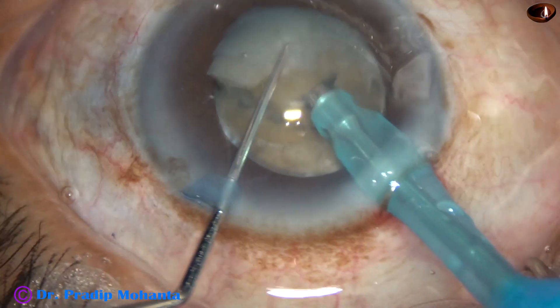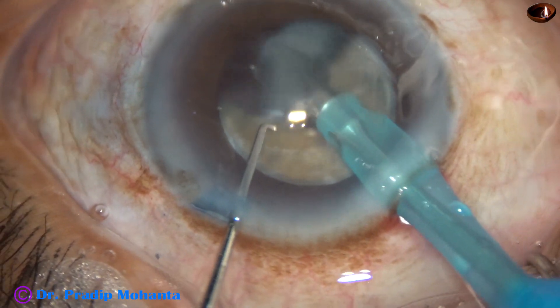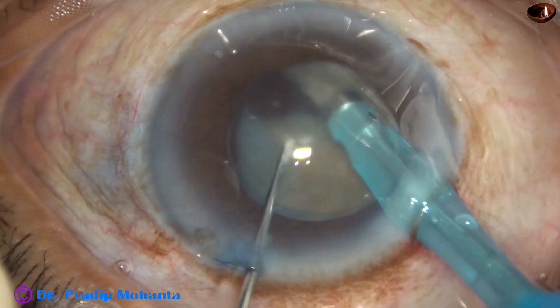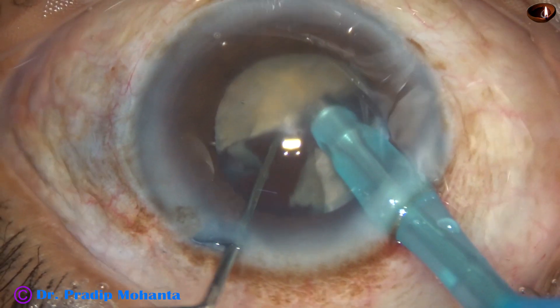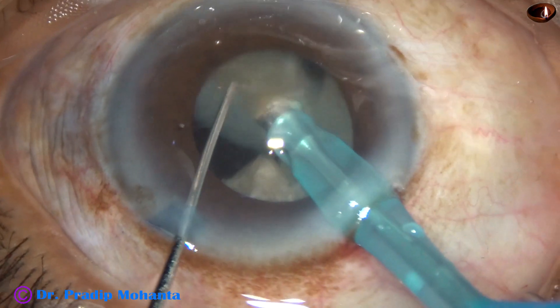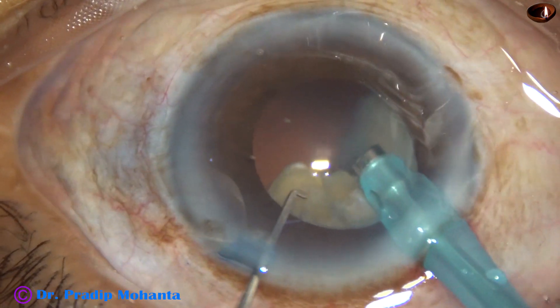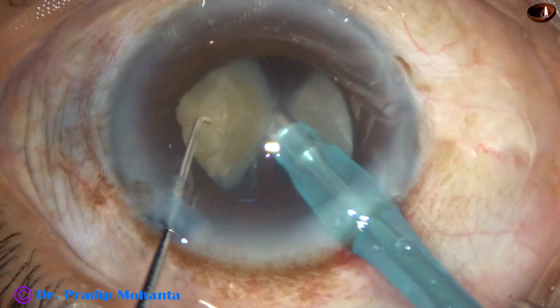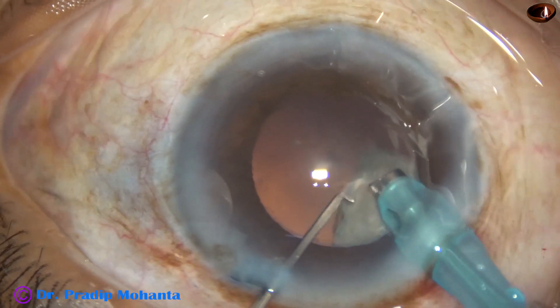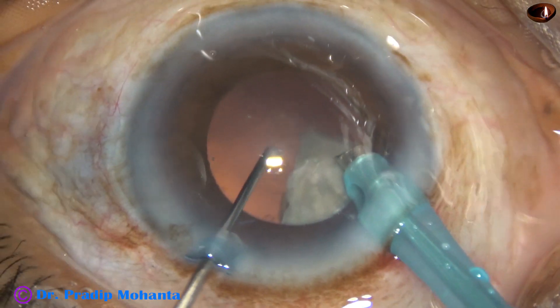Each hemi-nucleus is held with vacuum and subdivided into two parts. Each fragment is again divided if necessary, otherwise it is emulsified. The hemi-nucleus on the left is rotated and chopped again into two fragments. The attachment is broken and each fragment is then emulsified. This nucleus is about grade 3, brittle, and getting chopped very easily. Phaco power used is 70%, flow rate is 45 ml per minute, and vacuum is 450 mmHg.